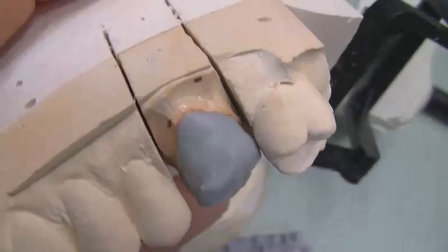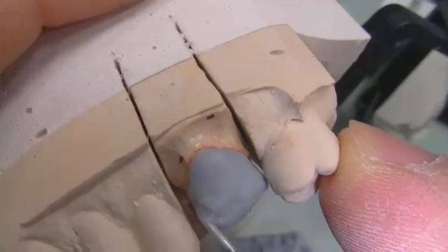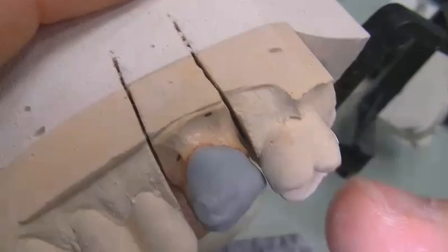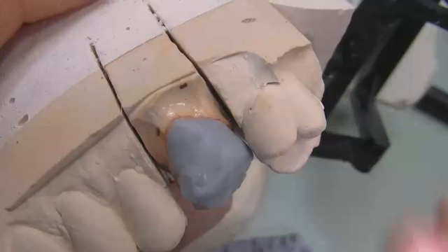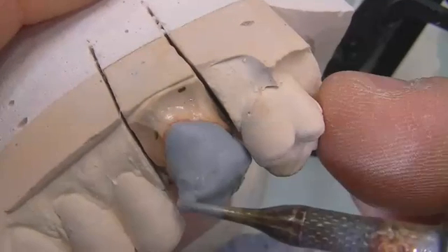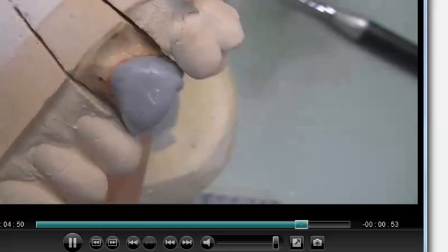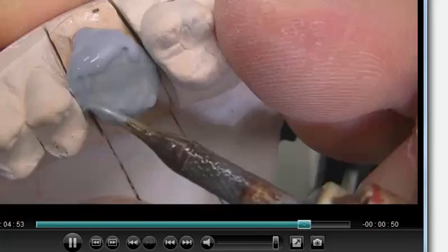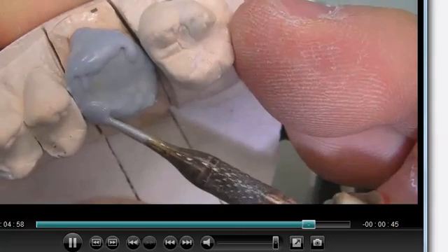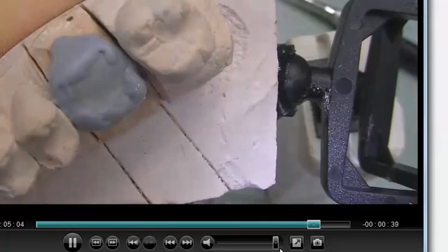Once the coping is done, we put it back onto the model and start to add wax to the buccal side. It's a big tooth, so we'll do quite a bit of addition — skipping ahead while continuing to add wax. Now we come to the occlusal table area, waxing up the mesial marginal ridge and distal marginal ridge to create the occlusal table.